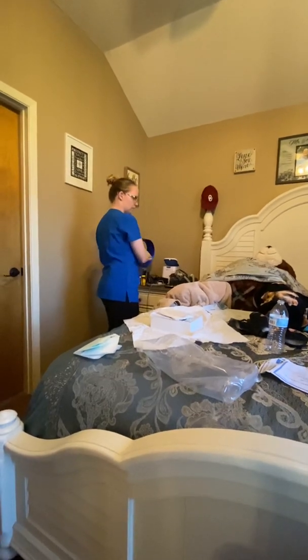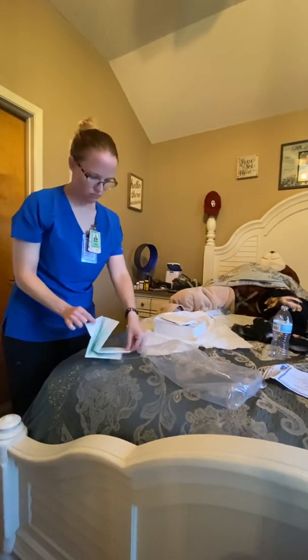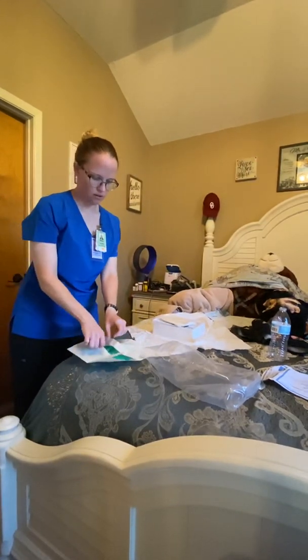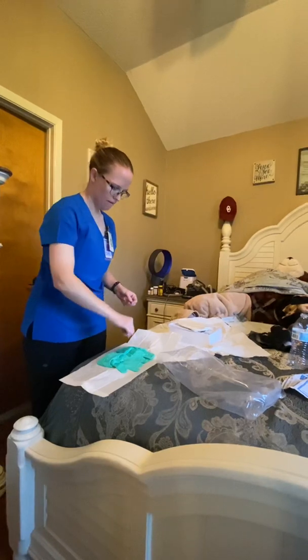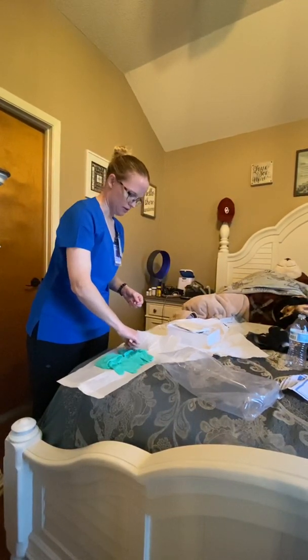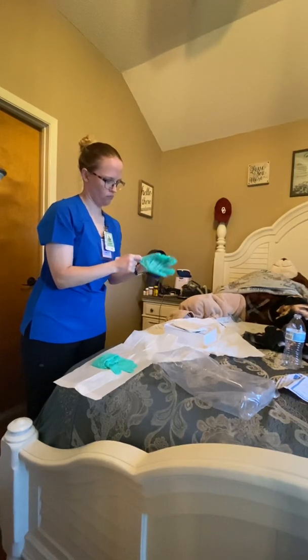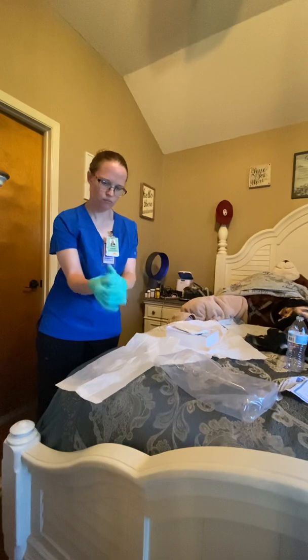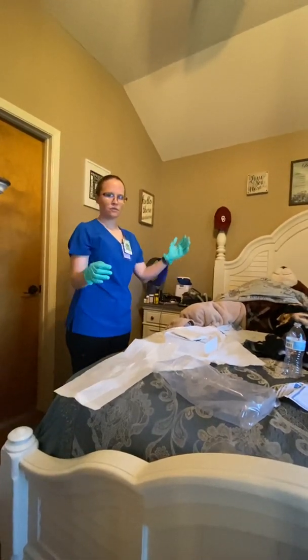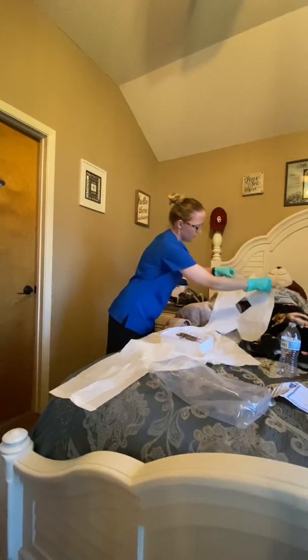Now, we're going to discard these gloves, and we're going to perform hand hygiene. And then we're going to put on our sterile gloves. We're going to act like this is a separate table, making sure that nothing touches anything, keeping a sterile field while we put these gloves on. Next, we're going to drape the perineum, making sure that the hole is right above the perineum.